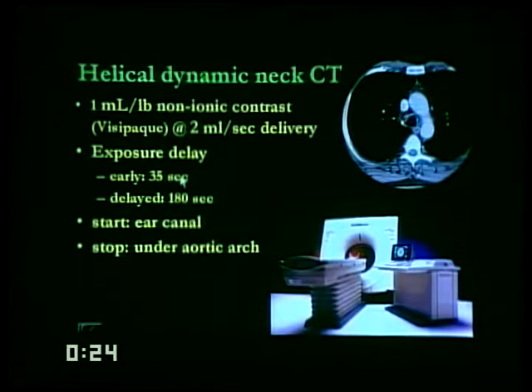Exposure delays for your early phase, which is your angiographic phase, is approximately 35 seconds, and then for your extracellular phase, 180 seconds. It's not always necessary to get the second phase in children. We do the early phase because you can look at vascular structures, you can look at early enhancement patterns. You do the delayed phase because you want to assess washout in certain anatomic structures, in all pathological structures, and most importantly, surface mucosal neoplasms. You're going to miss surface mucosal pathology if you don't have delayed phase imaging.